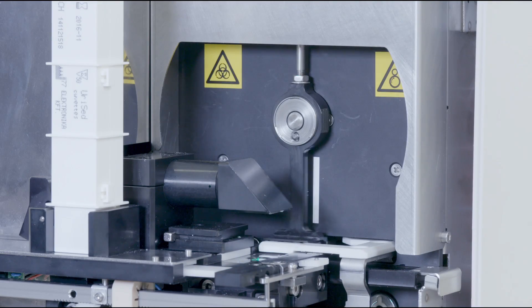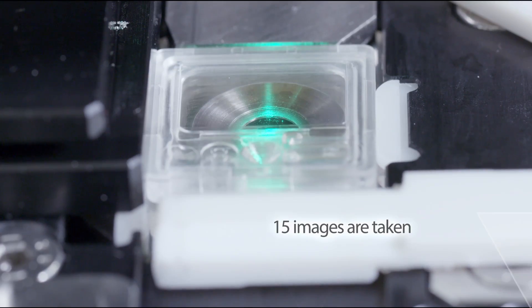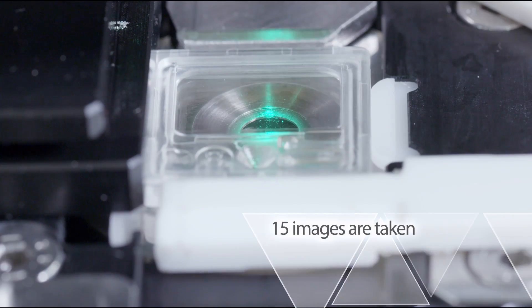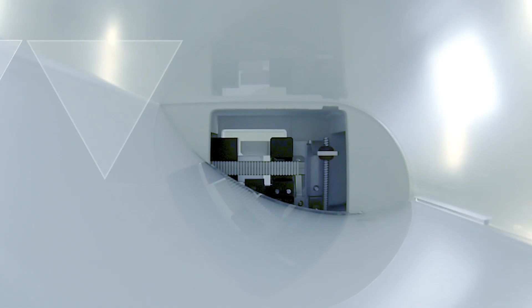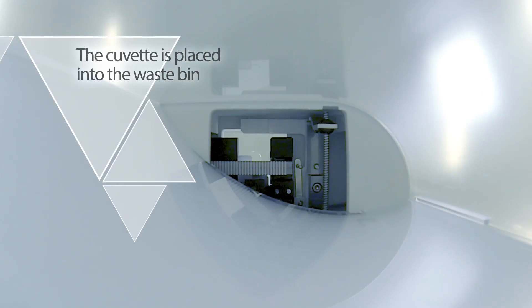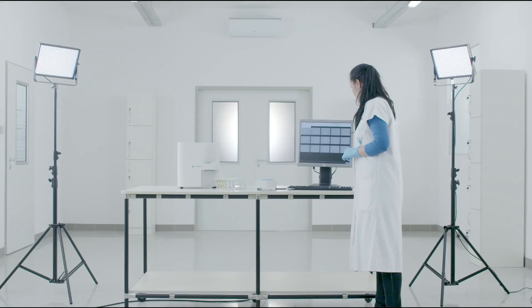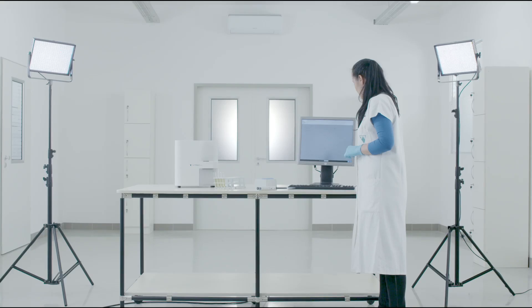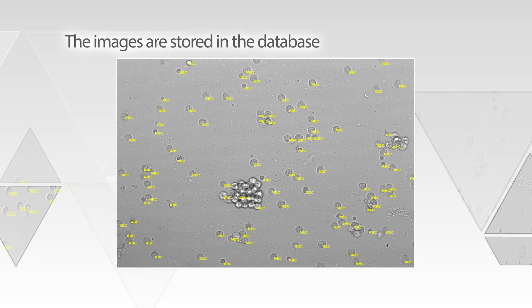The HPF-like images are automatically evaluated by a neural network-based algorithm. After the measurement process is finished, the used cuvette is placed into the waste bin. The images are stored in the database and are available in the gallery.